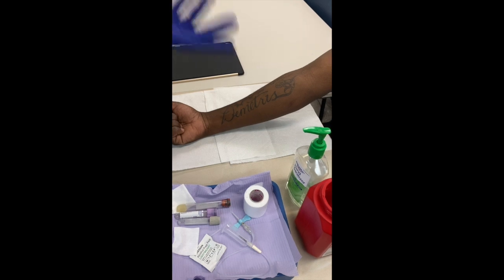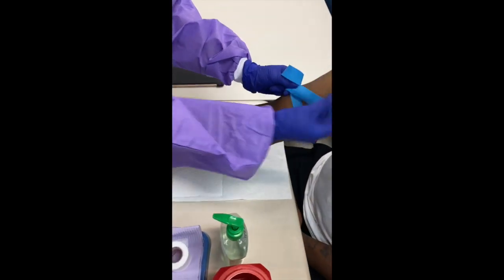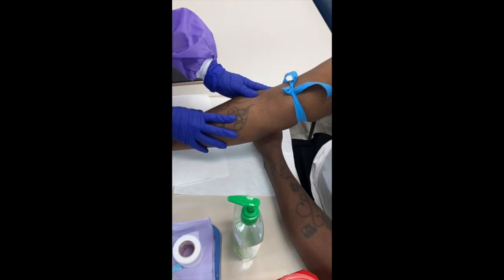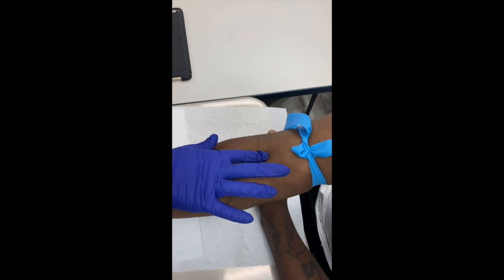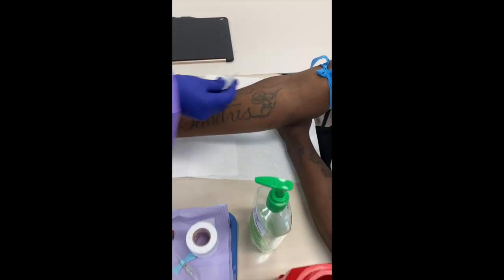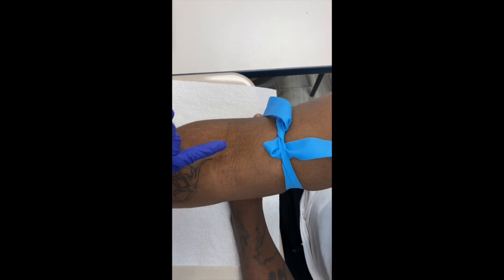Now that we've looked at one arm, we're going to look at the other arm. Even though I saw some nice juicy veins on the other arm, I'm going to still look at this one — it's just good practice to find the best vein. So bring this arm up, put your fist there, and let it rest. Now I'm going to poke around here, and I do feel a vein here. I'm going to show you what happens when we apply the alcohol — you can probably see that vein now, and it kind of goes up this way.